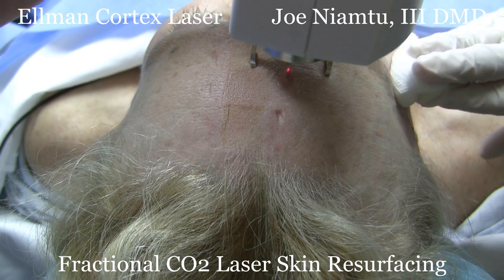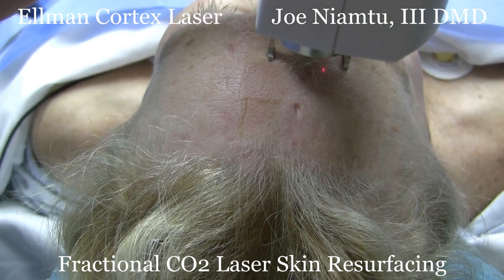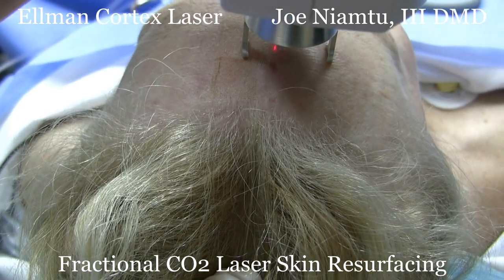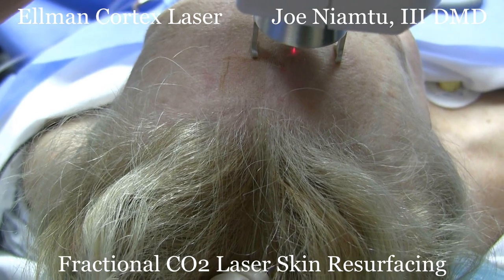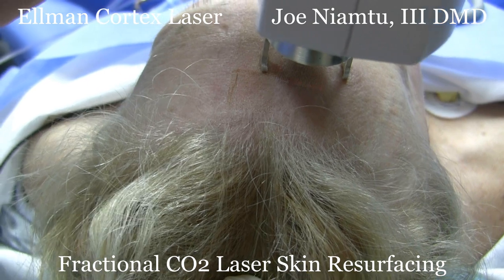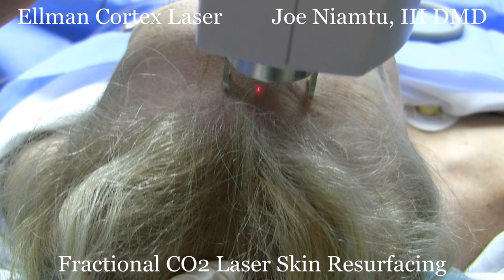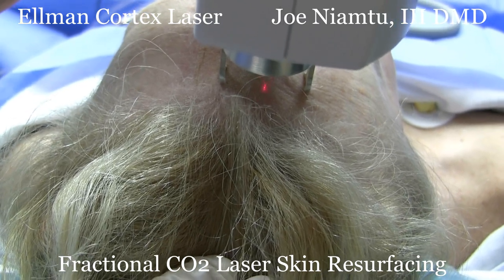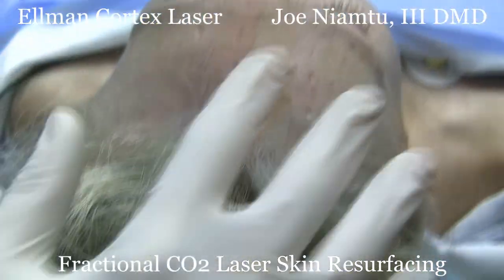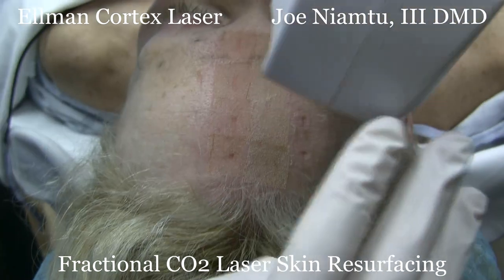Anytime you do laser you must protect the patient and the staff, and that includes protection from the actual laser beam and the smoke plume. You can see my one, two, three, four, five, six, seven, eight treated patches.